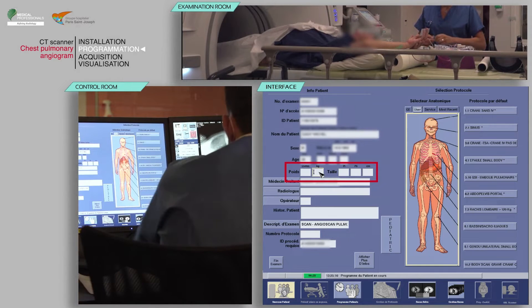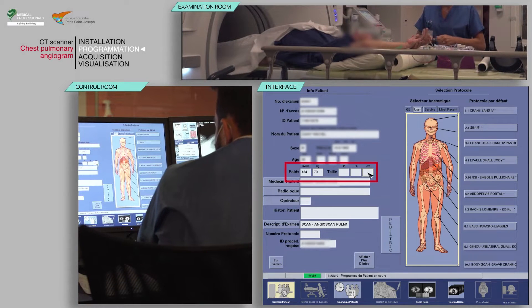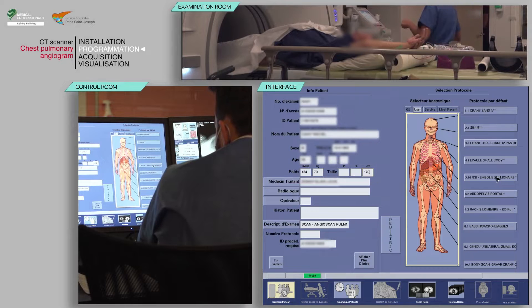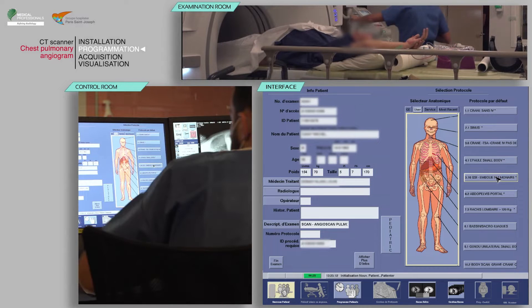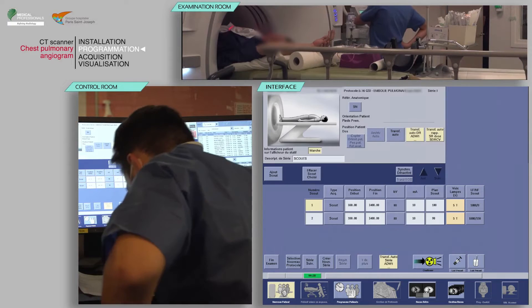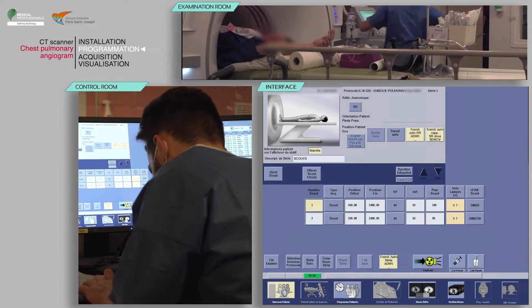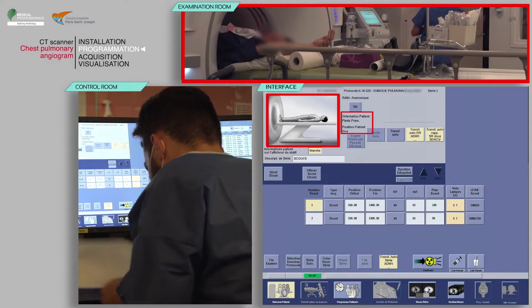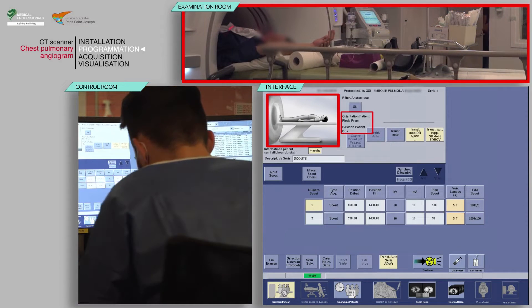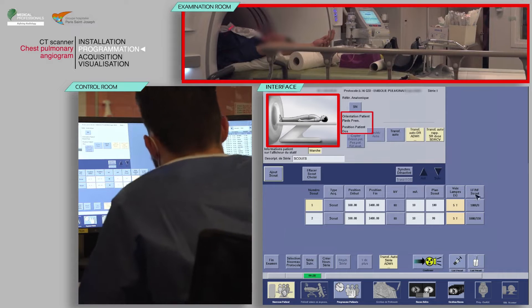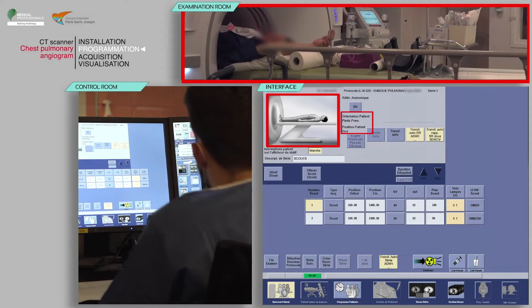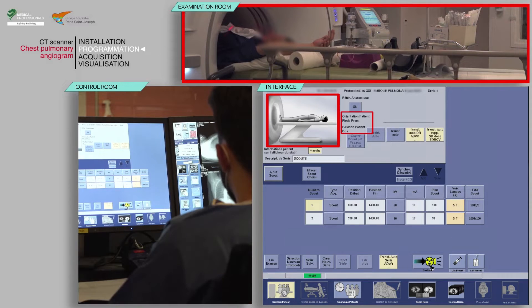Select your patient from the work list, then click Patient Selection. Verify that the pre-filled information is correct and fill in the patient's weight and height. Finally, choose the appropriate protocol. Check that the patient's position on the table matches the one indicated. Note that in the procedure shown here, the patient's orientation is feet first.